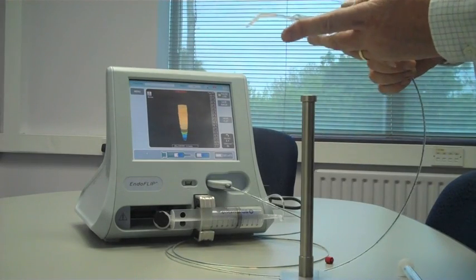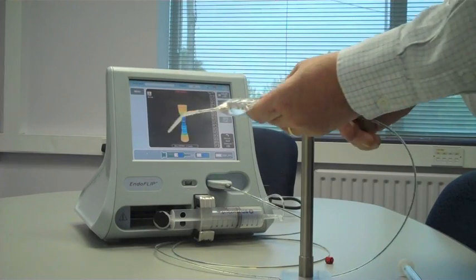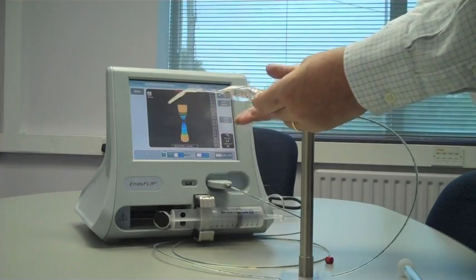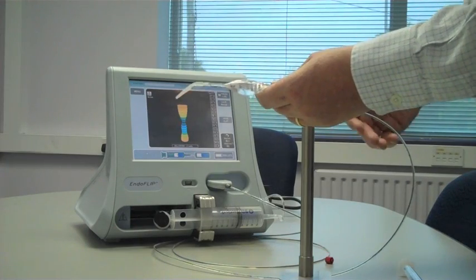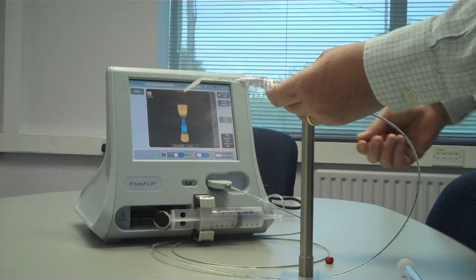So the default is 30mm. As you can see, when we squeeze the balloon, the shape of the esophagus or GEJ is clearly seen on the screen.